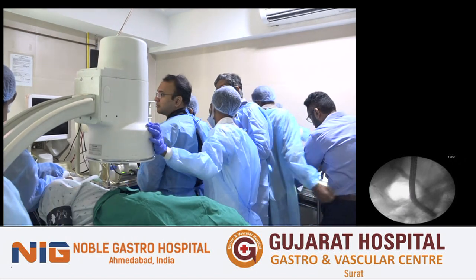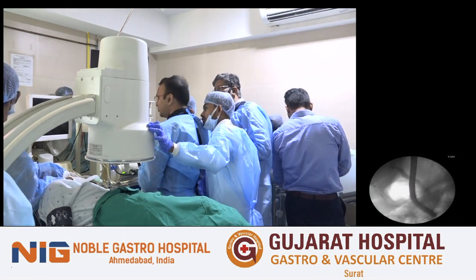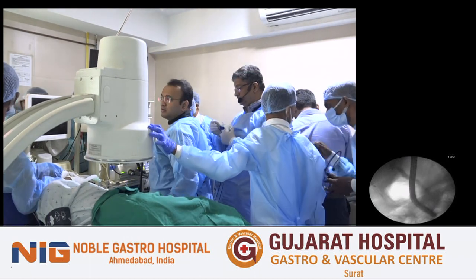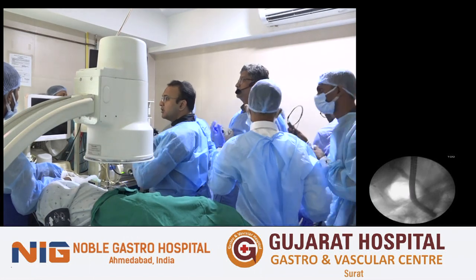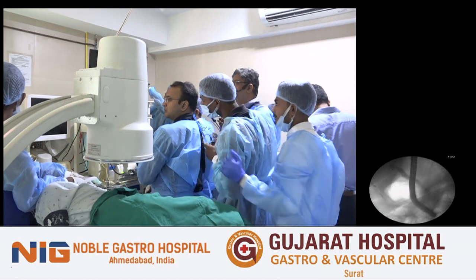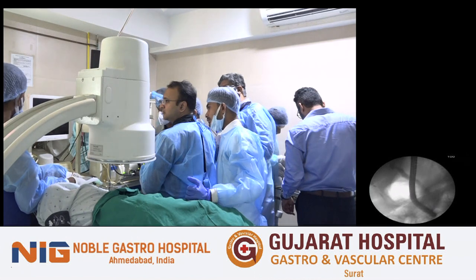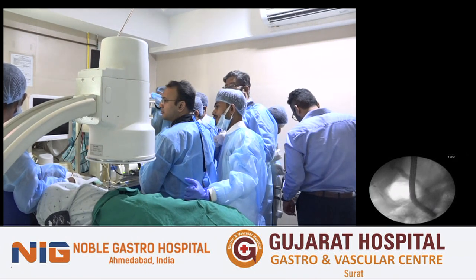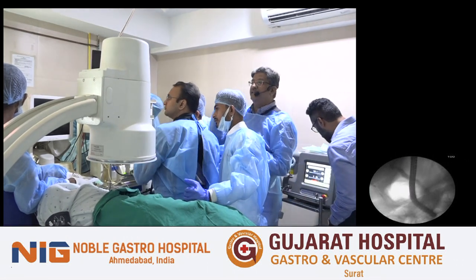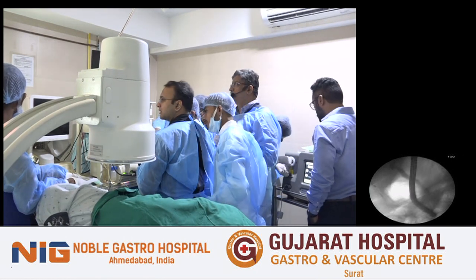In fact, you have opened the bile duct, so the bile is anyway going to come. But hardly ever, because of the bile leak, do we require any secondary intervention. Regarding CBD strictures, the incidence is 0.9%. That will directly depend upon the size of the CBD. When we are talking about an impacted CBD stone, obviously there will be a large diameter of CBD, so there is very little chance that the CBD will be strictured. Missed stone incidence is 3.5%. That can be decreased by direct cholangioscopy. And if you feel that, then obviously postoperative ERCP would help you out with that.